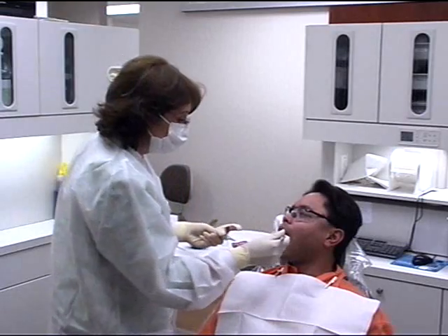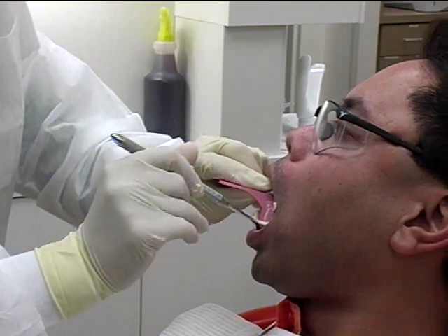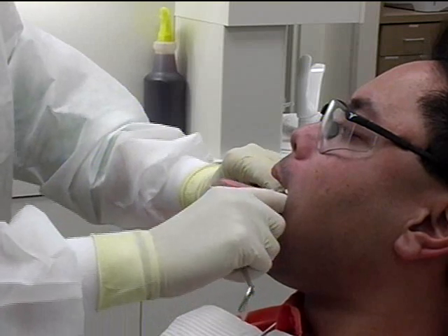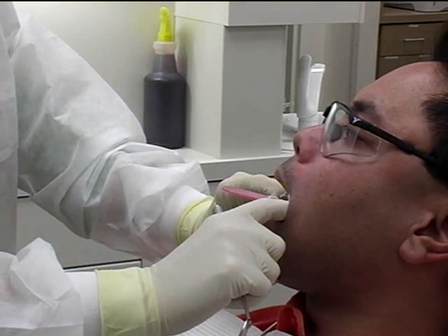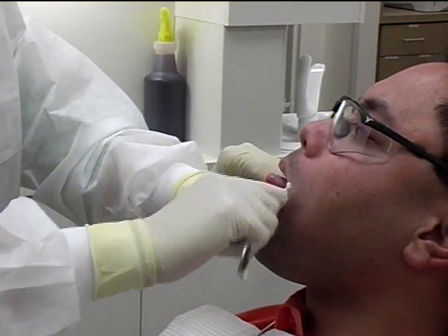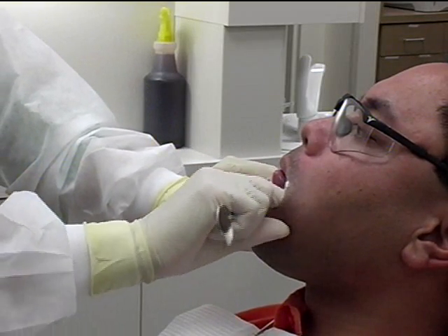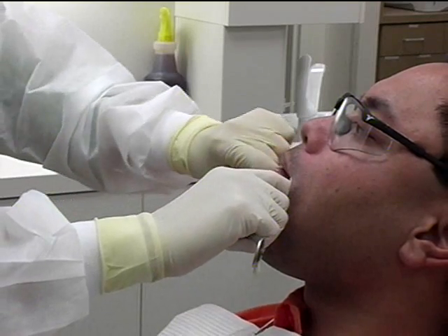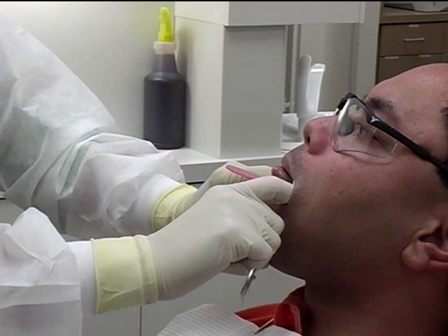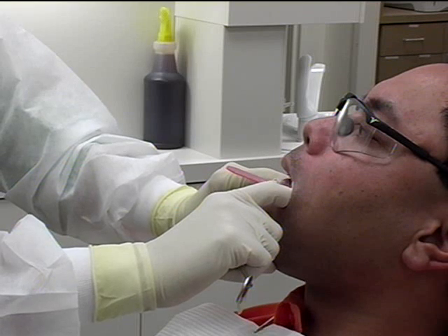With the mirror in the right hand, retract the cheek and rotate the tray in the mouth with the left hand. Center the tray over the teeth and seat it. Have the patient raise and protrude the tongue to get the lateral border from under the tray and to clear the posterior lingual flanges. Ask the patient to retrude the tongue and hold it in rest position.